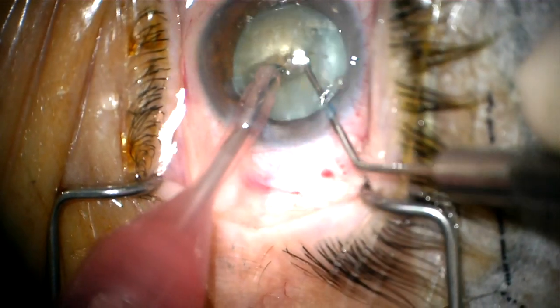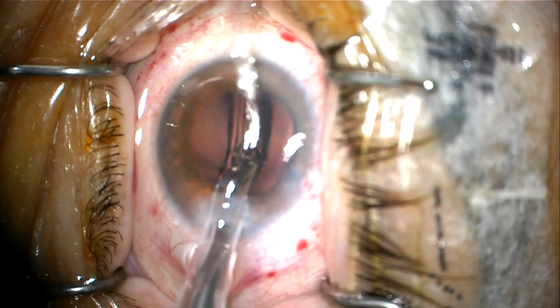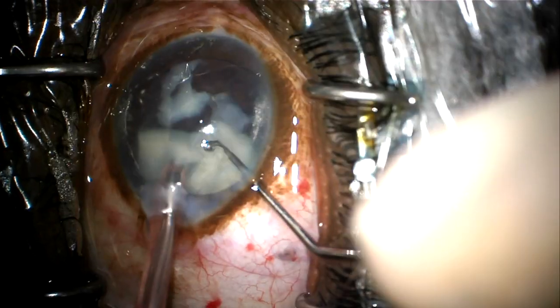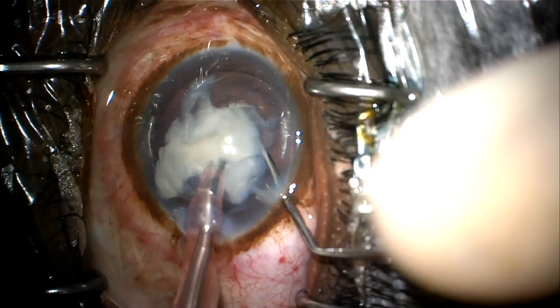Here is another example of using the femtosecond laser in this extremely dense white cataract and the complete capsular rexis. I avoid the lens fragmentation in these cases, as I find that it's difficult to penetrate through the lens itself due to the density of the cataract. But I find that in creating the capsular rexis this has been extremely helpful. And here is a third example of using this technology for these very complicated cataracts.